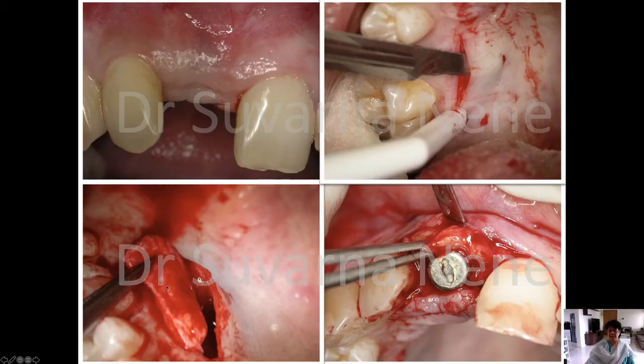And this was taken from the pouch of single incision, and it was placed, a subepithelial connective tissue graft placement. Today, if I do the same procedure, I would not create a pouch and I would not take the connective tissue from inside because this connective tissue is not very stable.